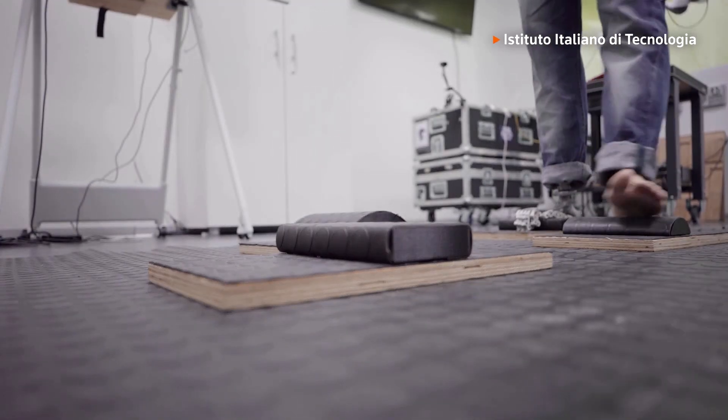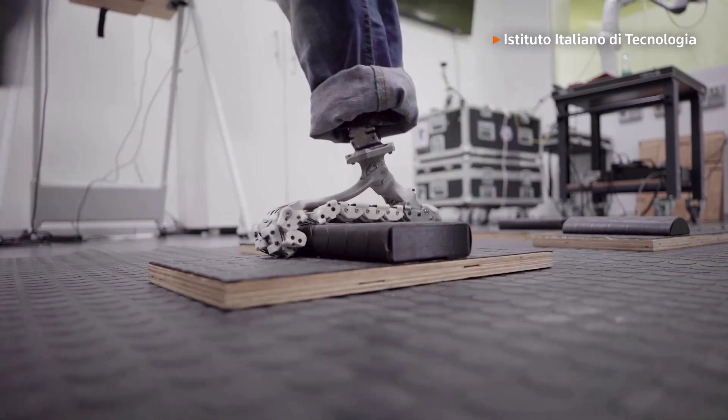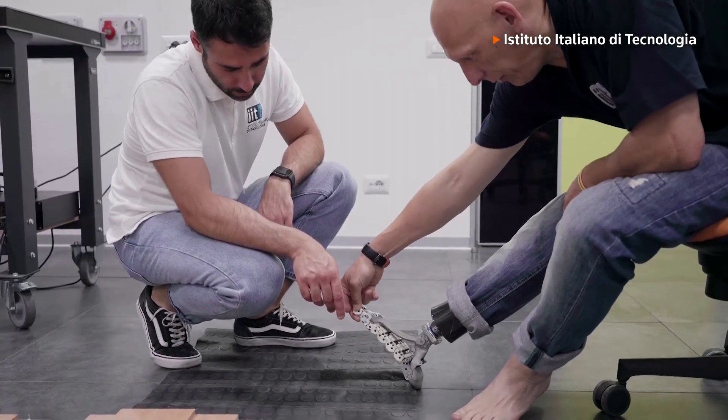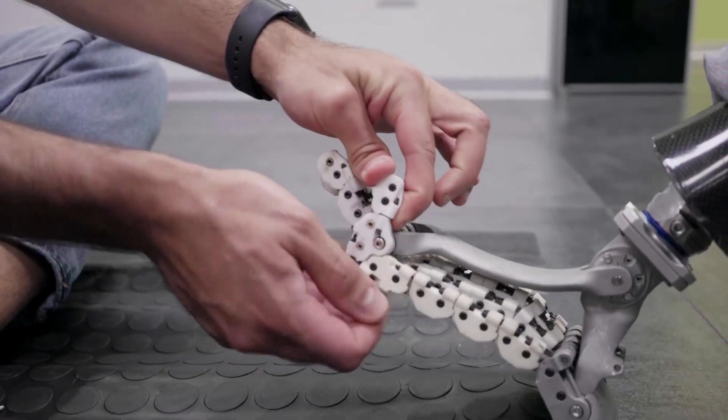This prototype prosthetic foot is designed to simulate the anatomy of a real human foot. Researchers think it could be a game changer for people with limb loss, and possibly for future humanoid robots.